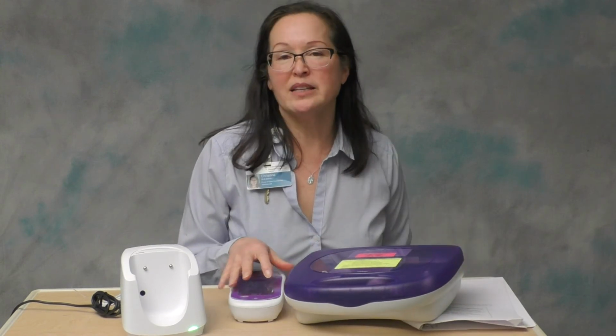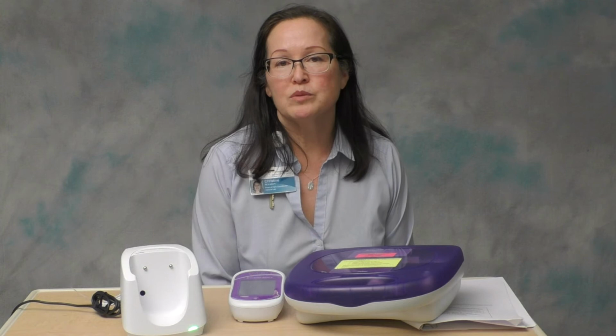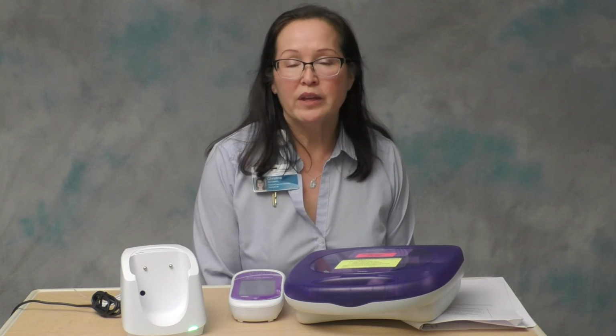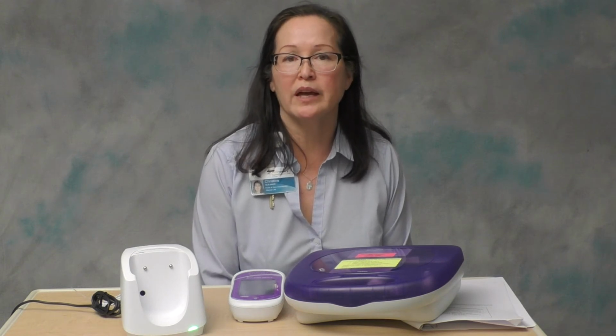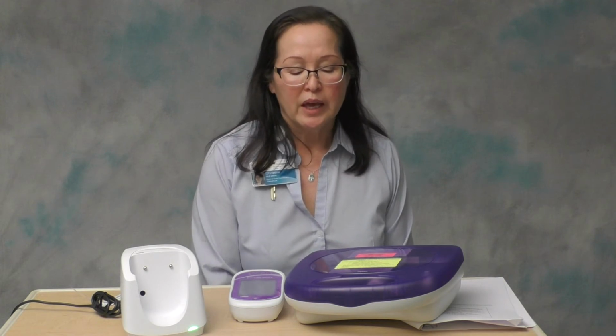If your patient has a hematocrit less than 10 or greater than 65, if they have triglycerides over 1,800 milligrams per deciliter, such as in acute pancreatitis, if your patient is receiving IV administration of ascorbic acid, or they have galactose levels greater than 15 milligrams per deciliter, and you can see that in hereditary galactosemia in neonates.